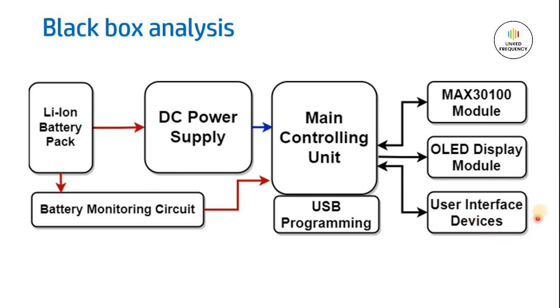We will have one user interface device which will help the user to select what function is to be activated and at what rate. If we are using this entire project for continuous heart rate monitoring, then we need one user interface where we can set the timing or set certain levels so that it will indicate something for the user. That's why we will have a user interface device.